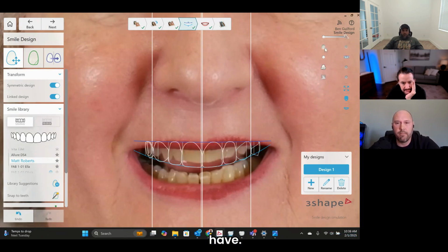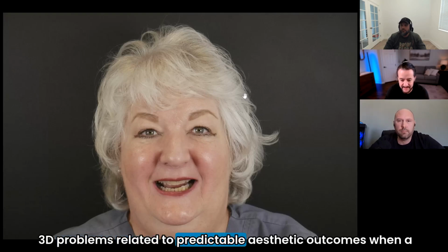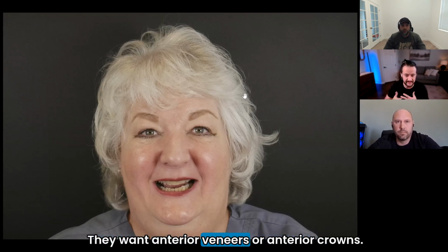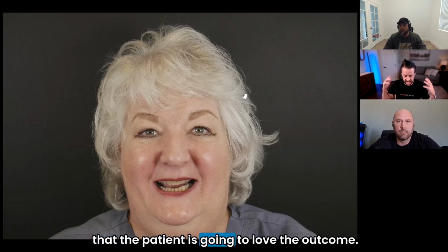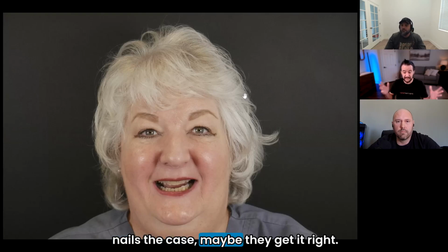Hello, Rob Lejeune, Ben Guilford, Daniel Pertal here to solve some 3D problems related to predictable aesthetic outcomes when a patient wants anterior aesthetics. They want anterior veneers or anterior crowns. They want that smile makeover. So we have a patient here, and if we just prep the teeth and send it to our designer or send it to our lab, how do we know that the patient is going to love the outcome? And if we're just crossing our fingers and hoping that the designer nails the case, maybe they get it right.